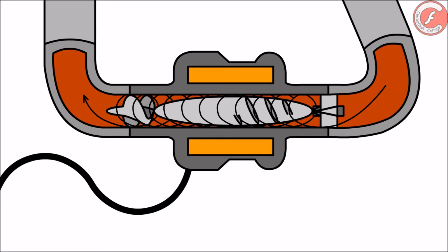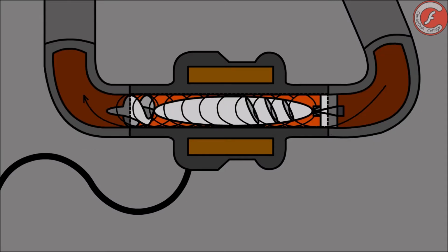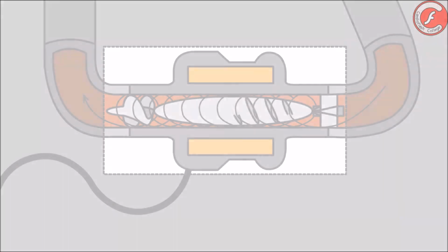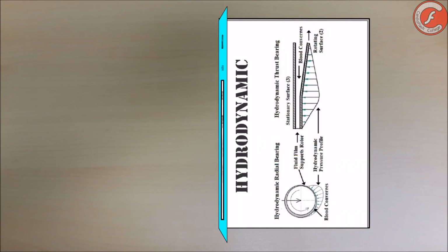So, we have to know that continuous flow LVADs are made up of an inlet port, an outlet port, and a single rotating element between them, all covered by a rigid casing that incorporates the engines, magnets, electromagnets, and/or mechanical bearings that move and hold the rotor. Well, let's dip a little into these bearing systems.